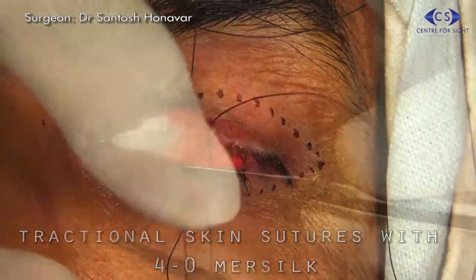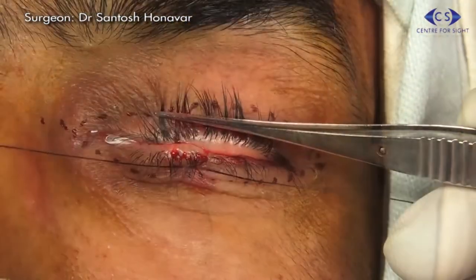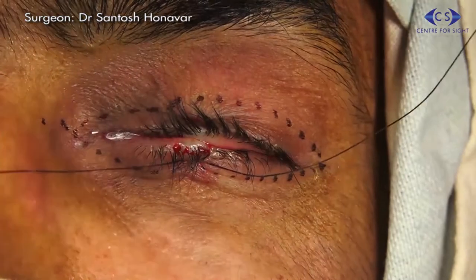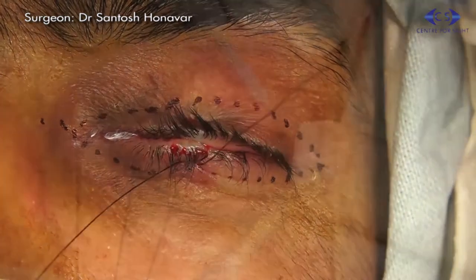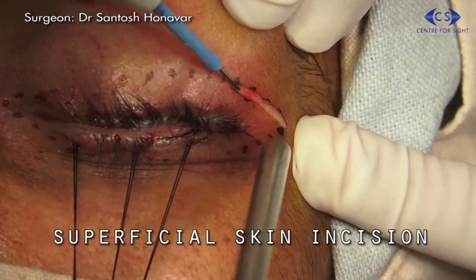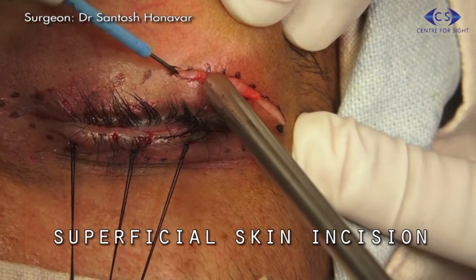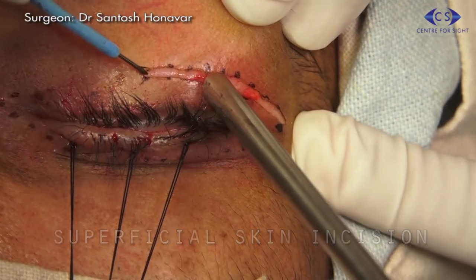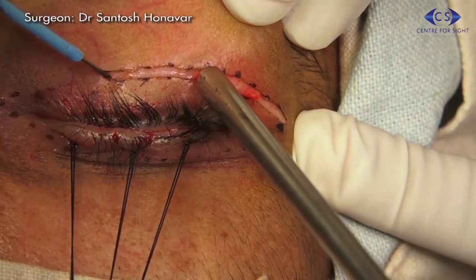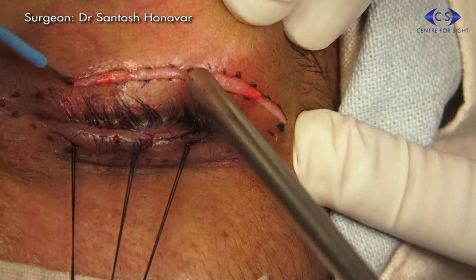Three traction sutures with 4-0 silk are placed through the upper and lower tarsus to provide traction on the orbital contents. The incision is then made with a radiofrequency probe along the skin marking.